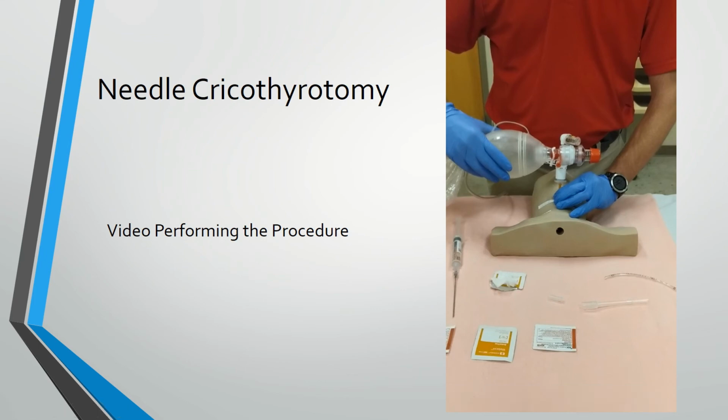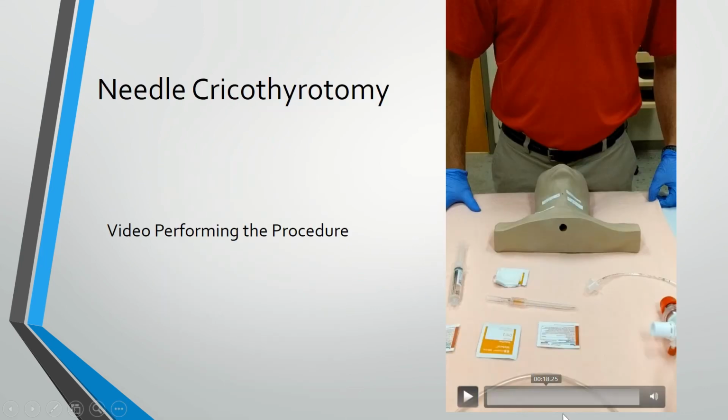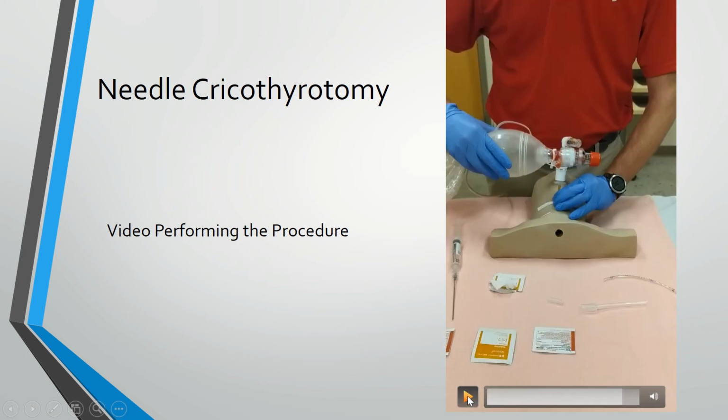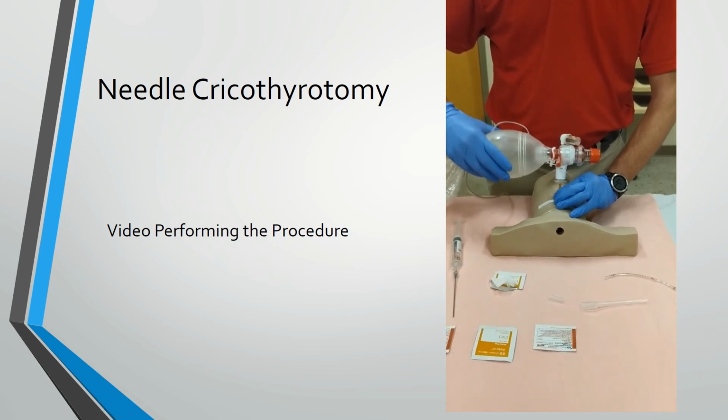I usually try to do that second one, let's go back here for a second. Sorry about that. Let's play that. So there's, like I said, 1 second. But that's just a nice slow squeeze. Like I said, you're going to meet a lot of resistance.